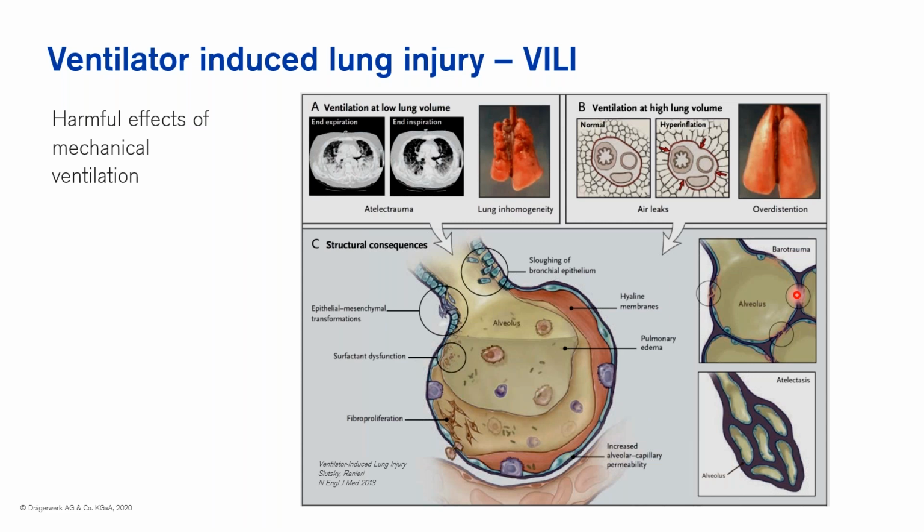And as a result, we would cause an extreme inhomogeneity in the patient's lung. We would then need to look at how ventilation is being distributed in the patient's lung, dependent on the inspiratory or expiratory cycle.